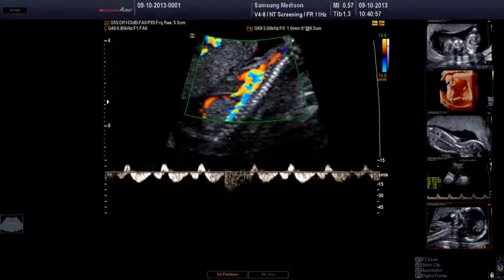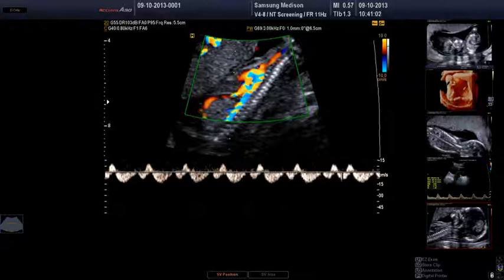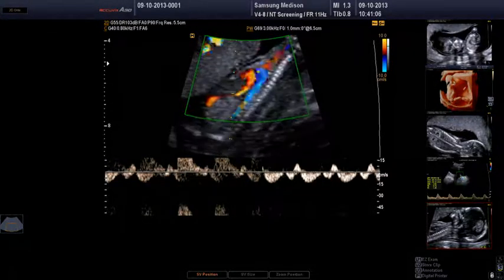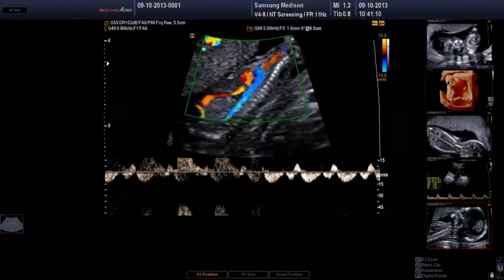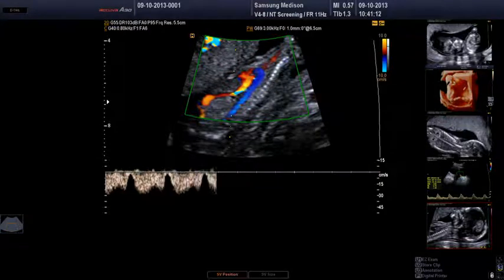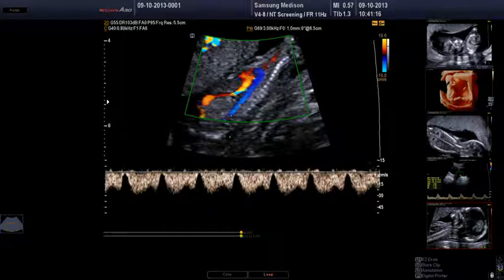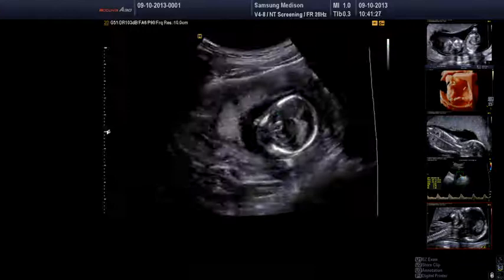So I'm demonstrating quite nicely there two different waveforms on top of each other. I suspect that's IVC that you're seeing there, and then the ductal was separate to that. So you see how easy potentially it is to make it look like you've got a negative A wave by planting one on top of the other. We'll just move on. We might just try and look at the fetal anatomy a little bit.